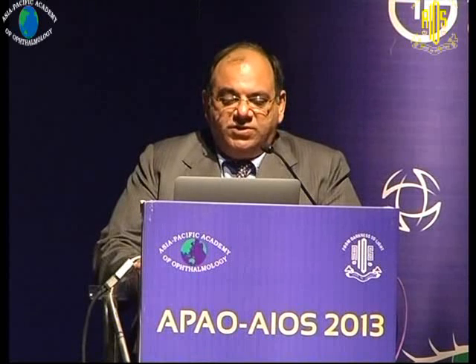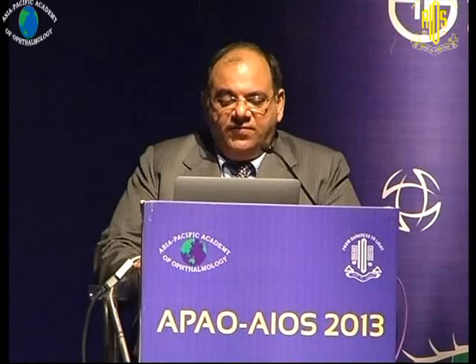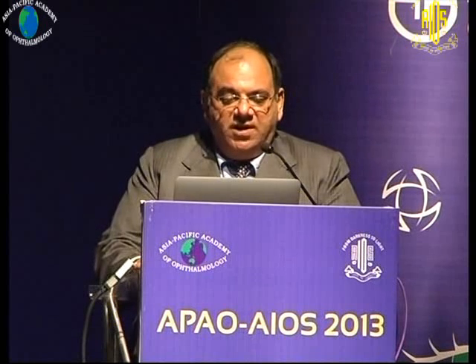So we do it in patients who have a significant cataract and require maneuvers like membrane dissection, both in the posterior fundus and also when tractional membranes exist anteriorly.